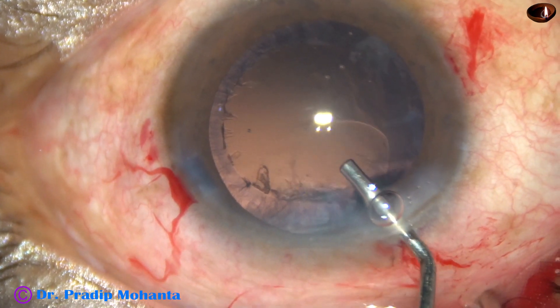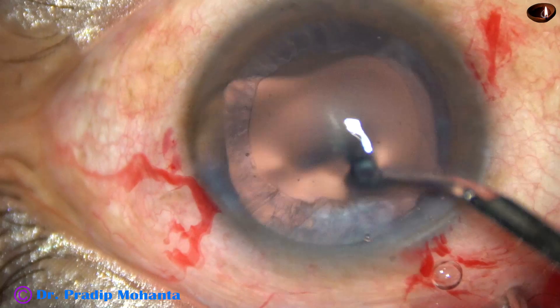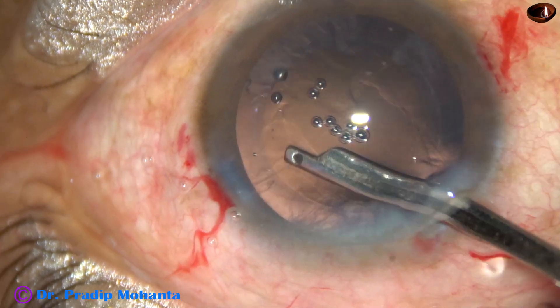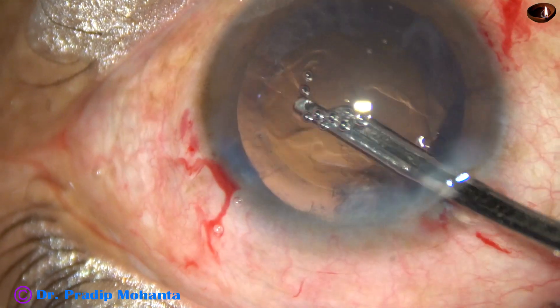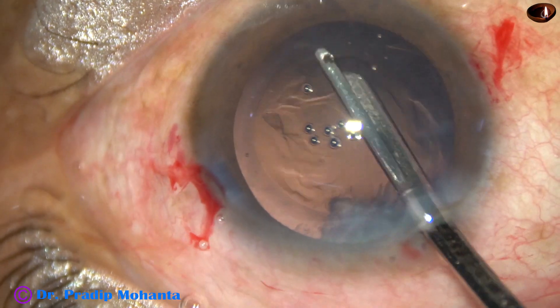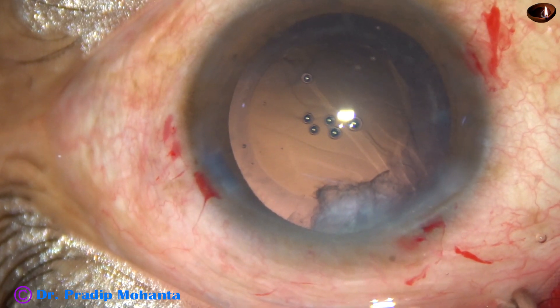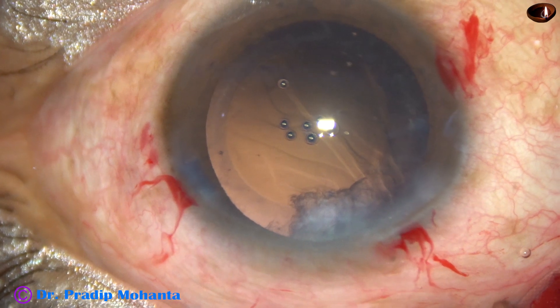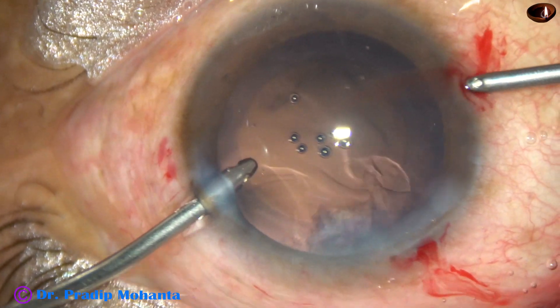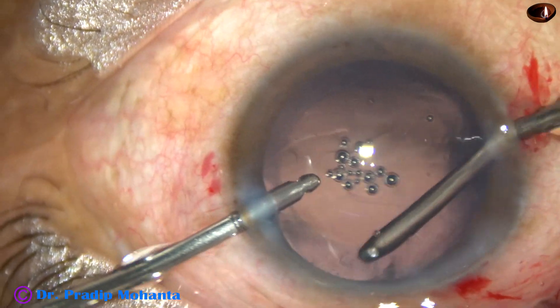2% HPMC is injected again. Now while my assistant gets ready with bimanual irrigation-aspiration, I take the 23-gauge Simcoe which is attached to a separate Ringer's lactate or BSS bottle. Most of the cortical matter from all around is removed except the sub-incisional cortex. For the sub-incisional cortex, I use bimanual irrigation-aspiration. In this case, irrigation goes through the left side port and aspiration through the right, and the sub-incisional cortex is removed very comfortably.